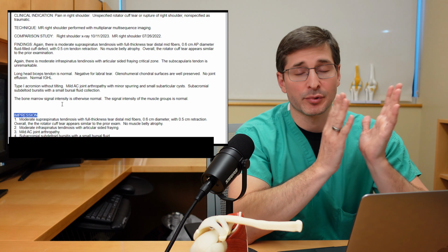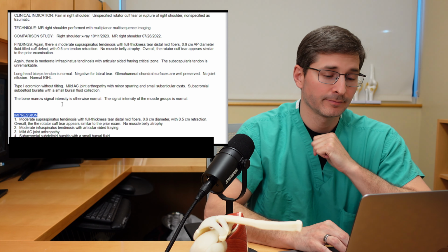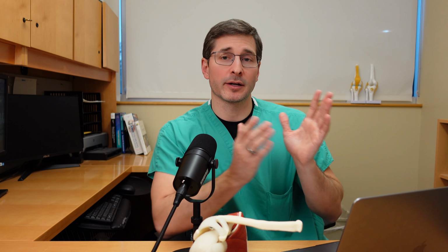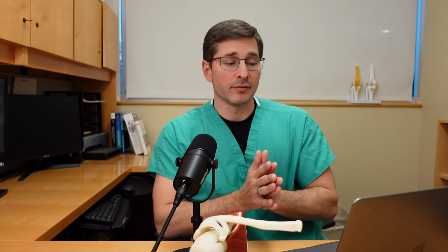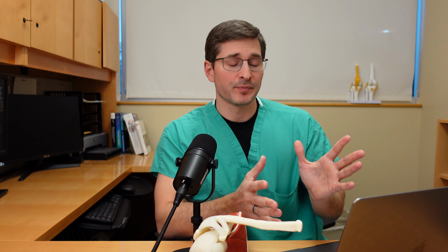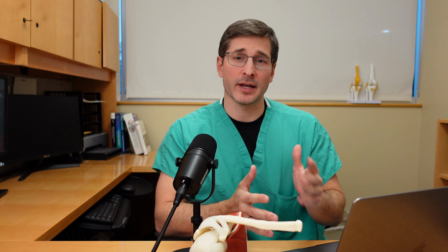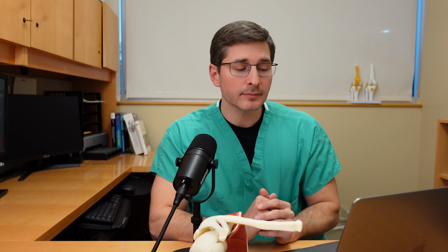So that pretty much concludes our third case. Well, there you have it, guys. Hopefully, by going over these reports, we've been able to put some of this terminology into context and to help everyone start to understand what they're seeing when they read their MRI report.